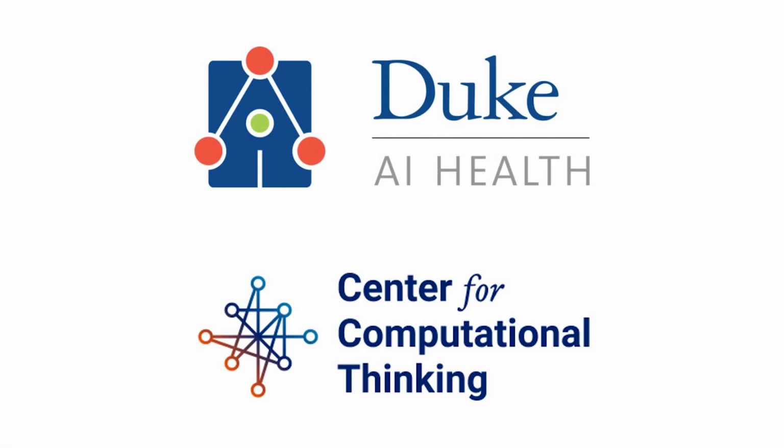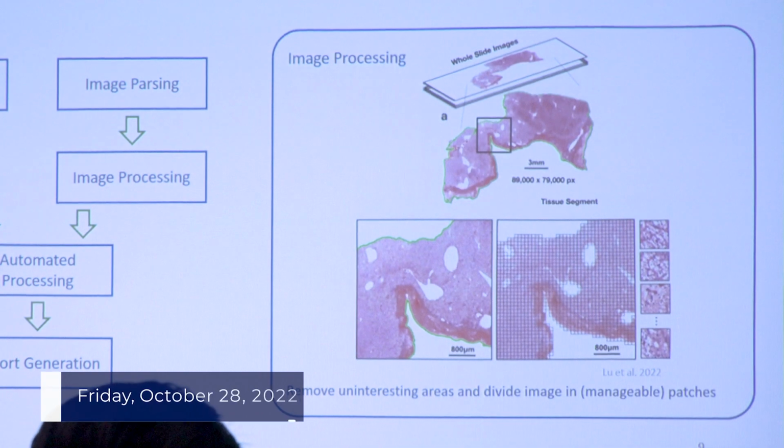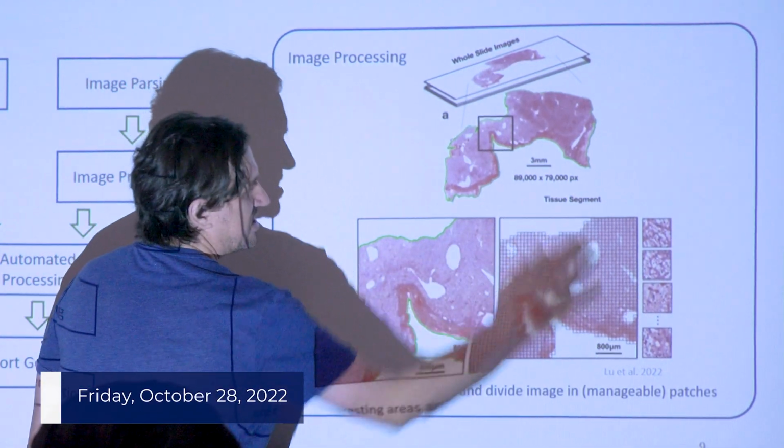You're going to get rid of all of those patches that have seemingly no information. You can see examples from the top and the bottom.